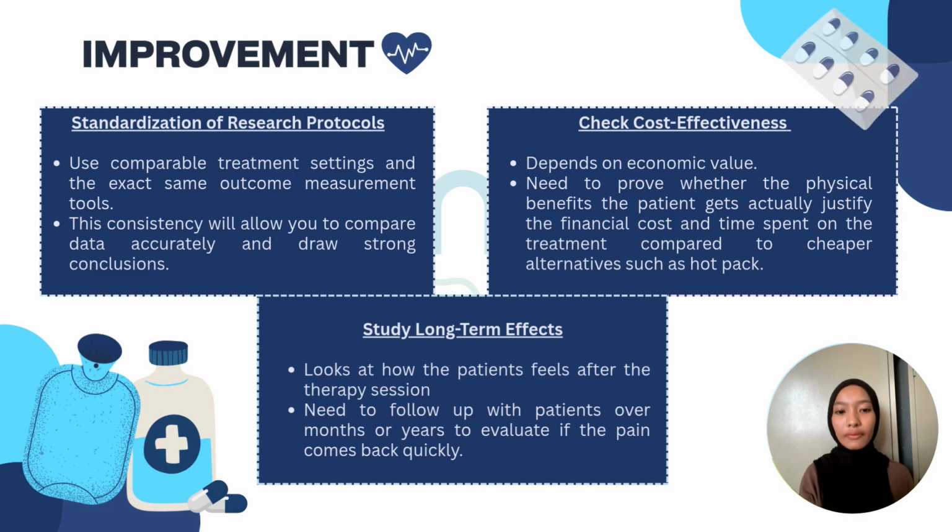Second, check cost effectiveness. It will depend on economic values. Need to prove the physical benefit the patient gets actually justifies the financial cost and time spent on the treatment compared to the cheaper alternative, for example, hot pack.